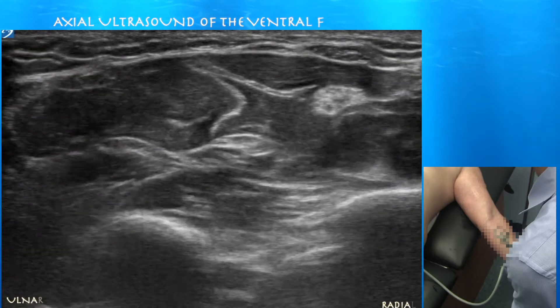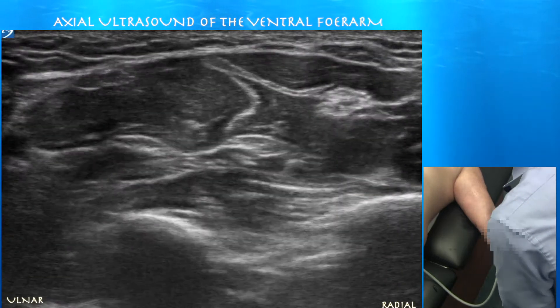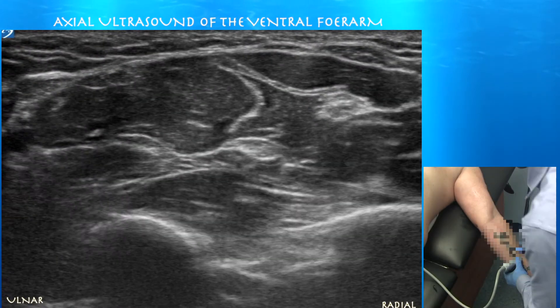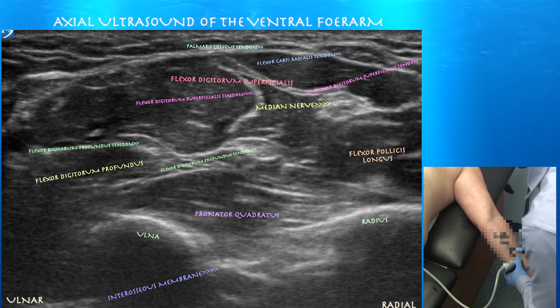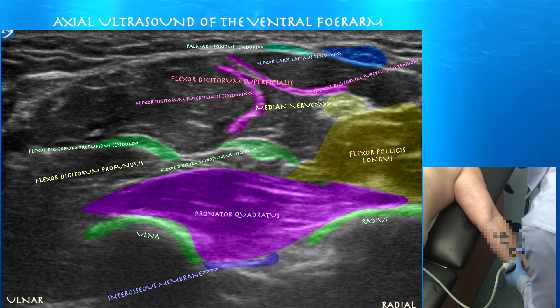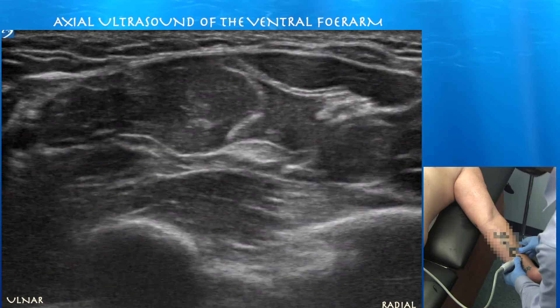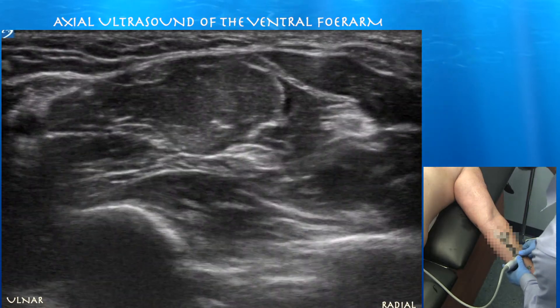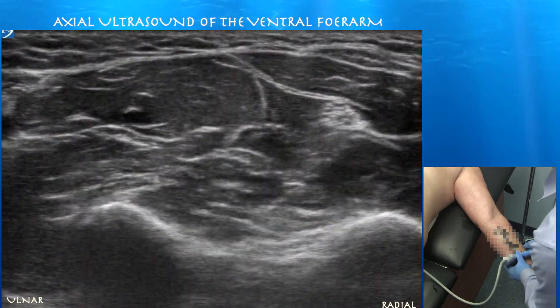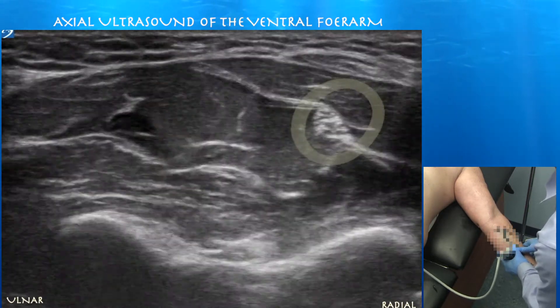Here's a close-up view. You can see the tendons beginning to form the flexor digitorum superficialis muscle and the flexor digitorum profundus. You can see the pronator quadratus muscle, which basically has fibers going about 90 degrees to the other muscles in the forearm. I'm going to go proximal now.